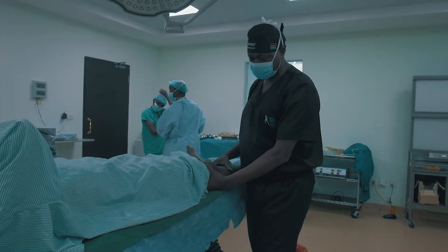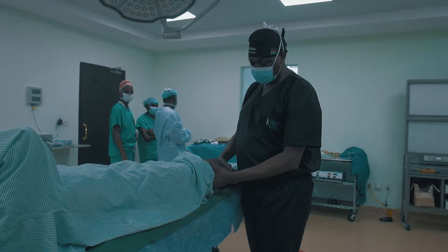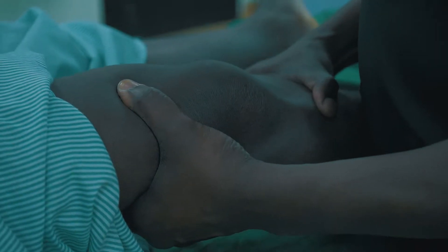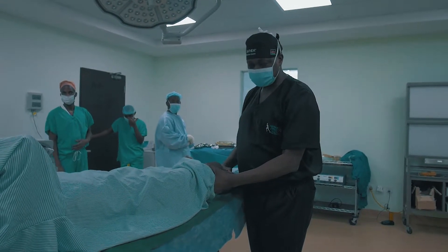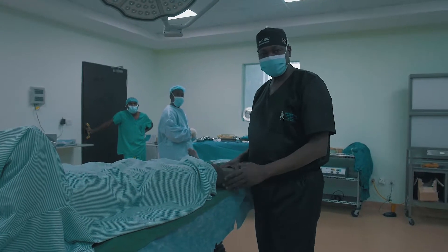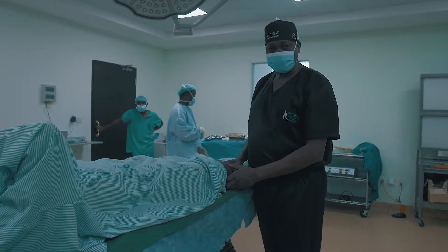This test is called the Lachman's test. At about 30 degrees of knee flexion, we fix the femur and you can appreciate this anterior translation of the lower bone, which is the tibia. This is a classical sign of an anterior cruciate ligament injury. We complement this test with an MRI to see what other structures may be damaged in the knee that may not be obvious using clinical examination alone.